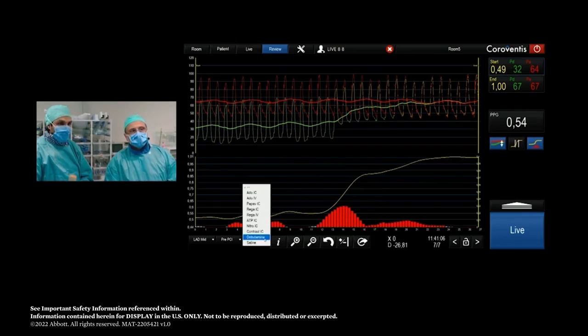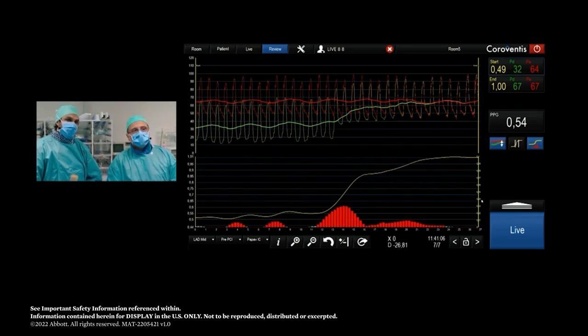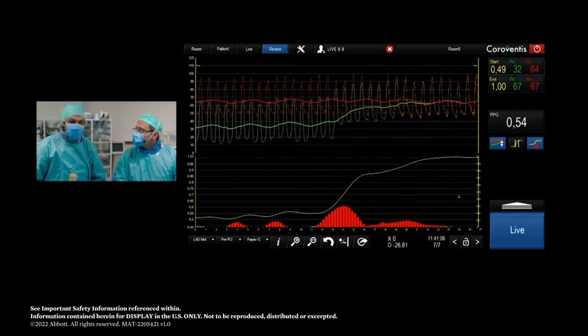It's perfect. So what I learned from here, Carlos, if I understand it well, is that first we can help this patient. There is some focal functional disease that we can certainly treat effectively with a stent. Most likely we will need a long stent, but this I think we will know more after the OCT pullback. So shall we move on? Perfect, let's go.